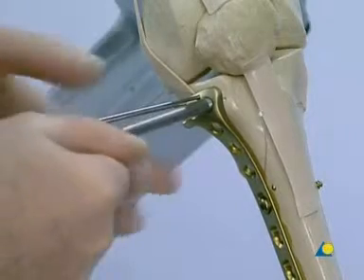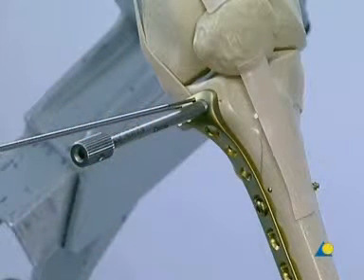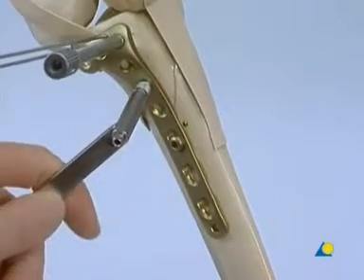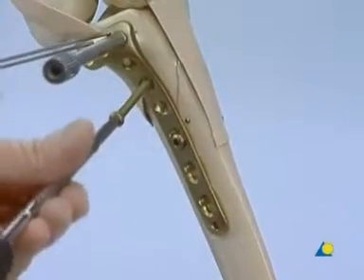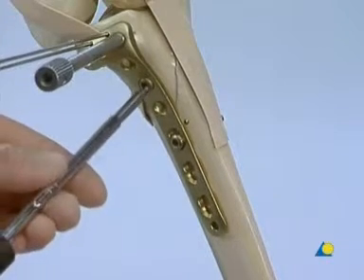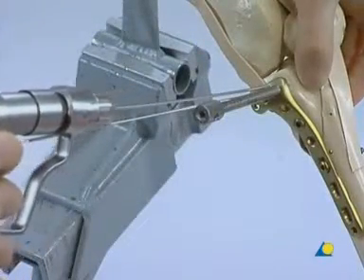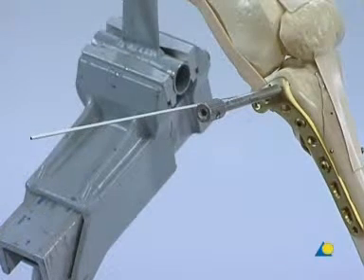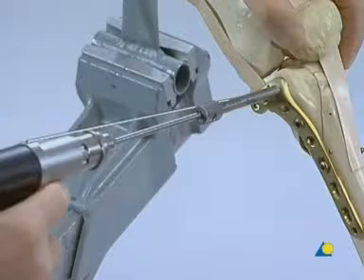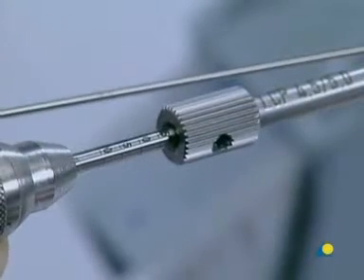The 5.0 threaded LCP drill sleeve is screwed into the most anterior of the proximal plate holes; this drill sleeve will show the direction of the most proximal locking head screw. The plate is secured to the bone proximally by using a 4.5 mm cortex screw. The two cortex screws are tightened sequentially to maximize the buttress effect. The anterior K-wire is removed to avoid collision with the drill used for the anterior hole of the proximal end of the plate. The hole is drilled using the 4.3 mm drill bit, and the screw length can be taken from the markings on the drill shaft.